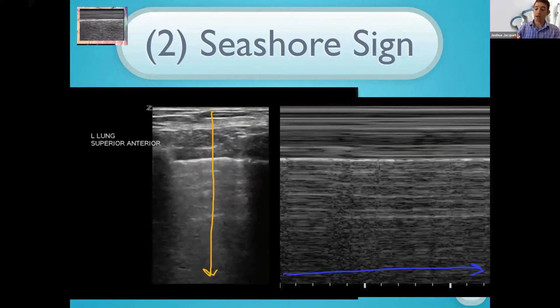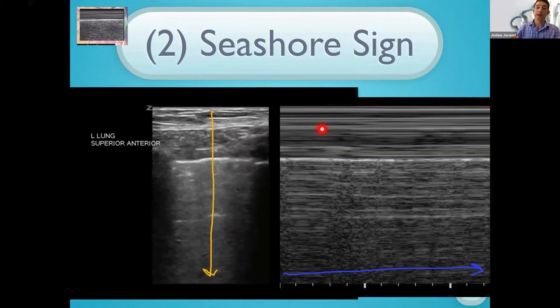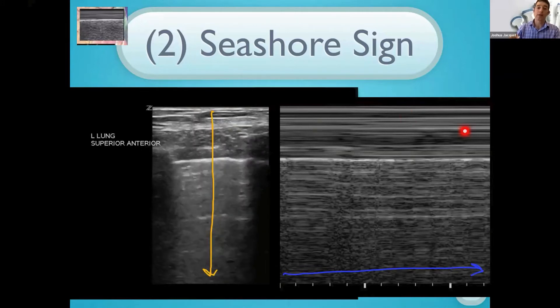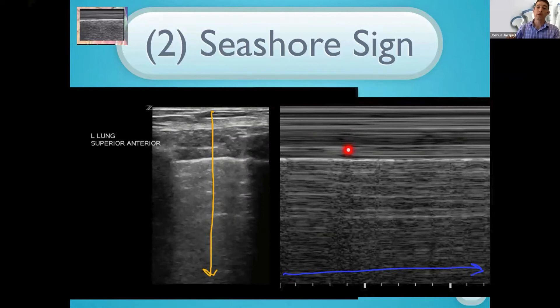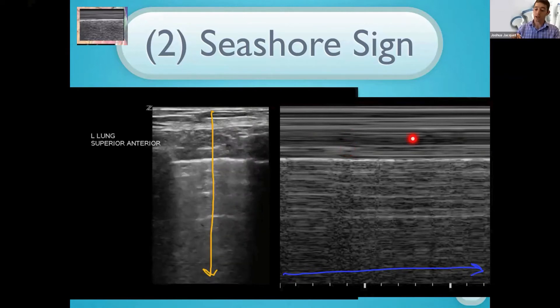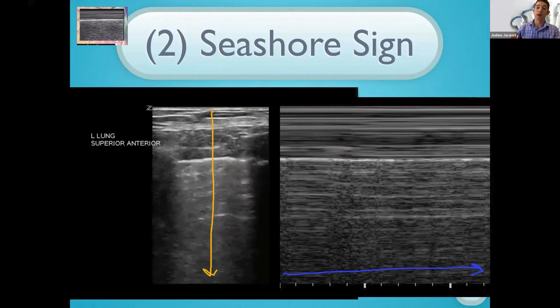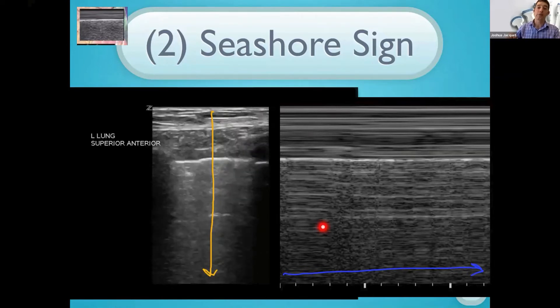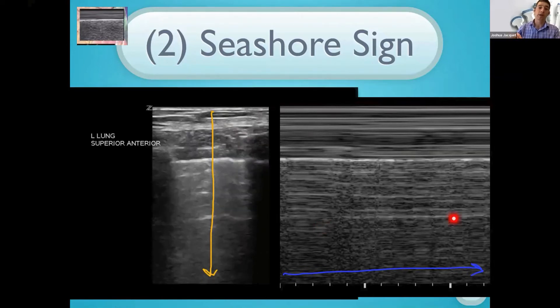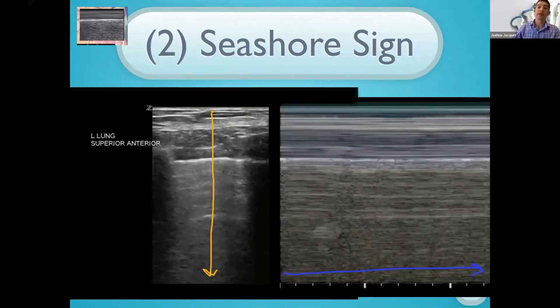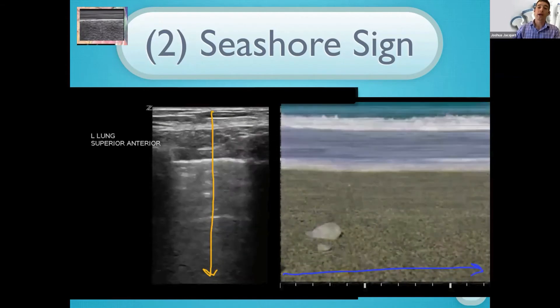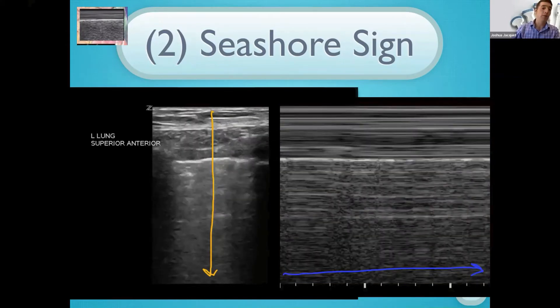In M-mode, the compartment above the pleural line appears relatively static — straight lines — with some respiratory movement in the muscular and intercostal segments, which is normal. Below the pleural line you have a grainy appearance corresponding to that sparkling: the seashore sign, like waves coming into the shore hitting the pleural line, and then sandy beach below. That's the M-mode equivalent of lung sliding — normal lung.